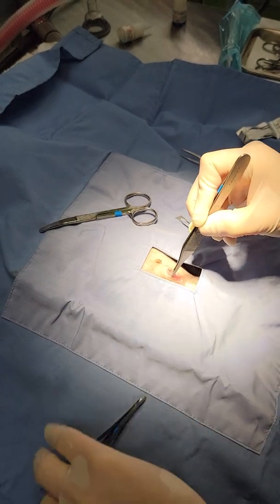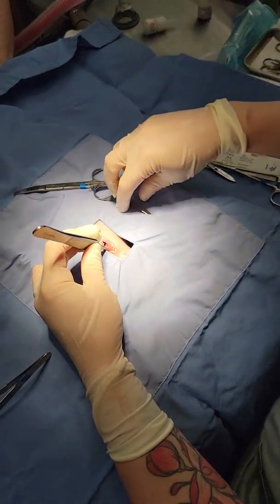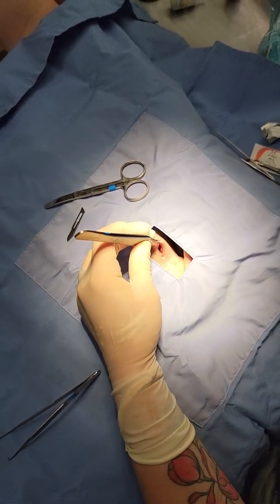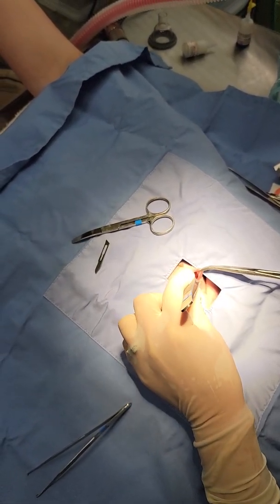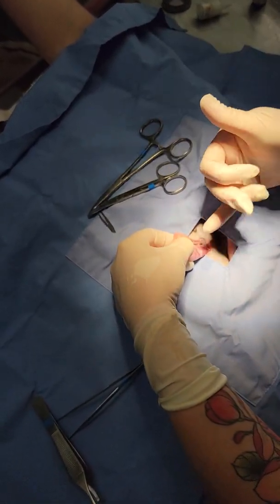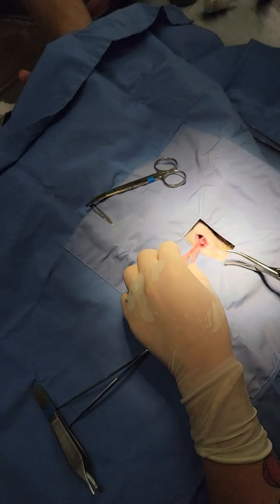At this point I can normally find the testicles. In the beginning I definitely had to have an assistant kind of agitate them up. So I'm going to have Jason show you what he's going to do. He's going to take his non-sterile hand, come under the guinea pig, and agitate the testicle on the left side. What I'm holding here in my hemostats is the linea, and I'm looking over here and I can see the fat moving. In an adult guinea pig it's going to be a really well-formed fat bundle. So this is obviously the left testicle — I've exteriorized it. You'll notice here it's attached to the inside of the scrotum, so I'm just going to gently break that down and clamp.